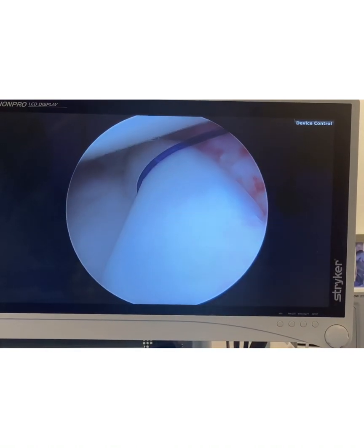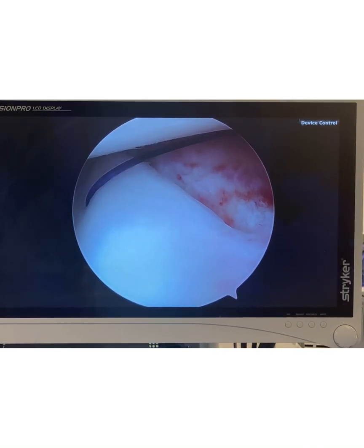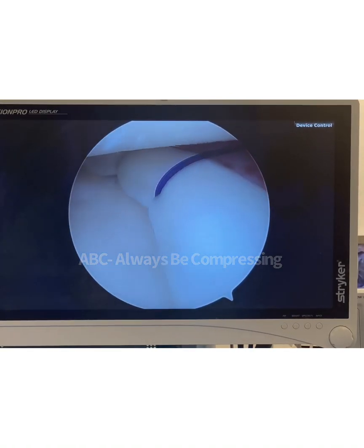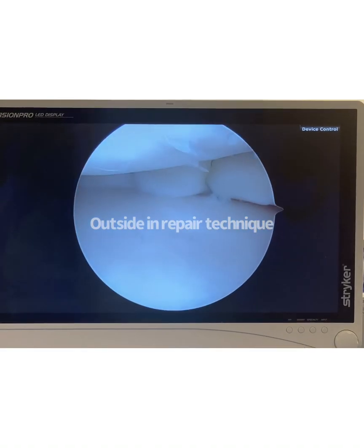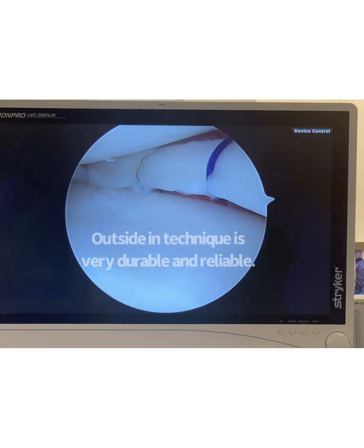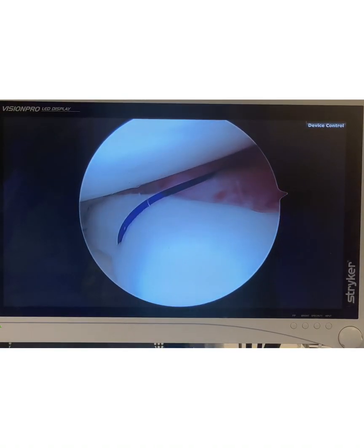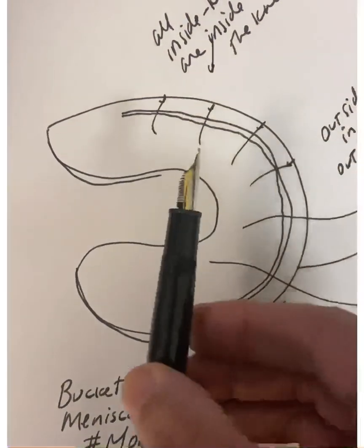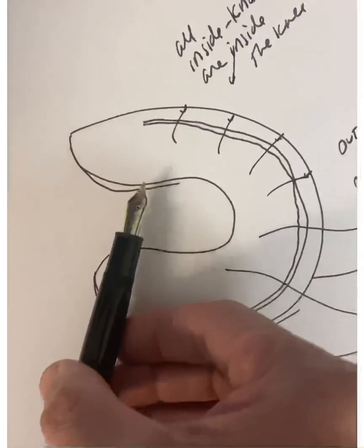That more permanent suture is going to do some of the final closing up of this meniscus tear. You see that gap? I'm going to put in a couple of these sutures — it won't be the blue suture, it will be a braided suture. You see what he's going to do — sort of close it up like that, bring it up against nice bleeding tissue right there. This is called an outside-in repair using the Smith & Nephew menders. I already did some all-inside suturing over there. Dr. Mori here showing you how to repair — you guys take care, have a great day.